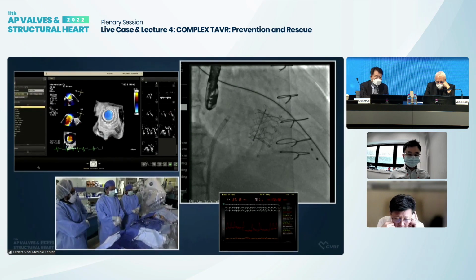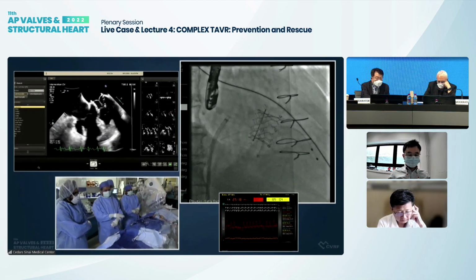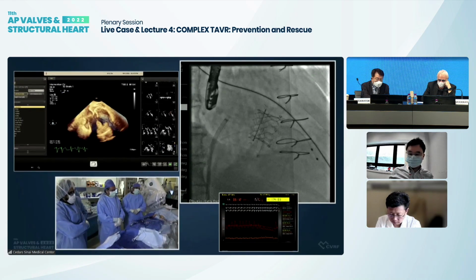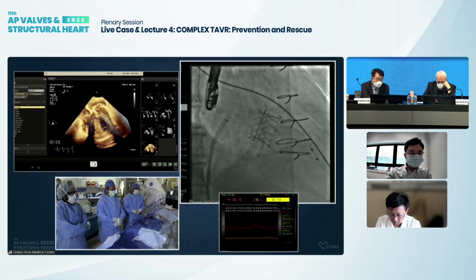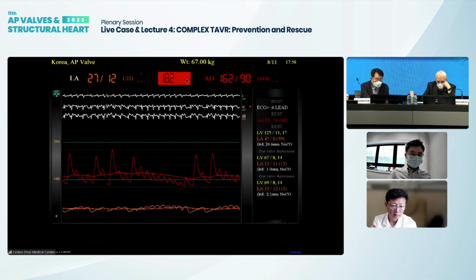The valve structurally looks very intact. Okay, so our pressure is a little high. It's going to start to settle down. But the high pressure helps the air get out. So at times you do that. RV can be tricky in some of these patients, and I think you have to support them through it.